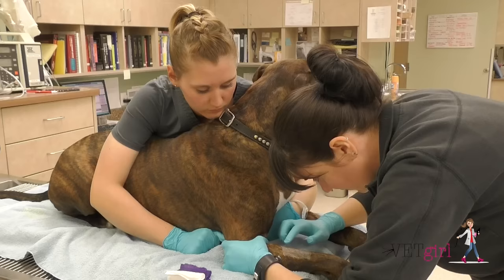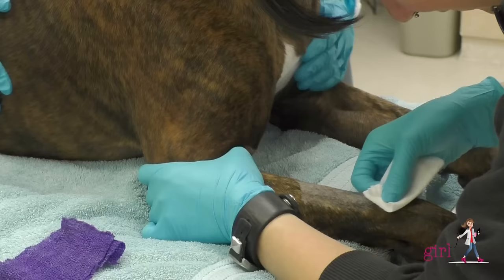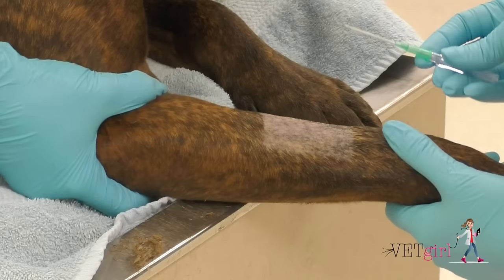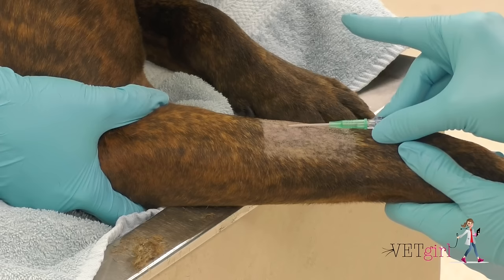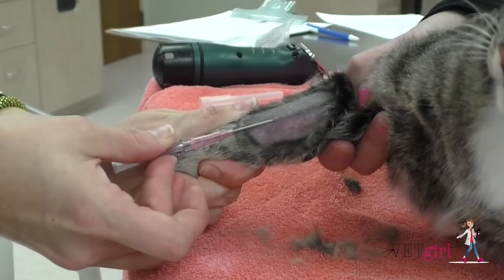Carefully open an appropriately sized catheter while maintaining sterility. Inspect the catheter to make sure that there are no defects, abnormalities, or burrs on the catheter. Palpate the vein above your sterile insertion site to visualize where you want to place the catheter, making sure to keep the site sterile and clean. While holding onto the hub of the catheter, insert the IV catheter directly into the vein at an approximately 10 to 30 degree angle.